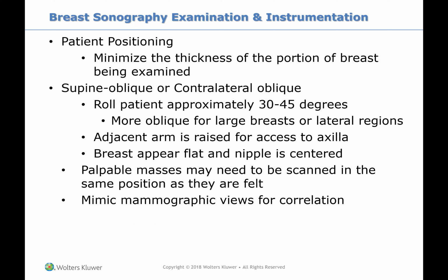So patient positioning, you minimize the thickness of the portion of the breast being examined. Usually this means I roll the patient 30 to 45 degrees towards me or away, depending on which breast you're looking at, to minimize and flatten out the breast.